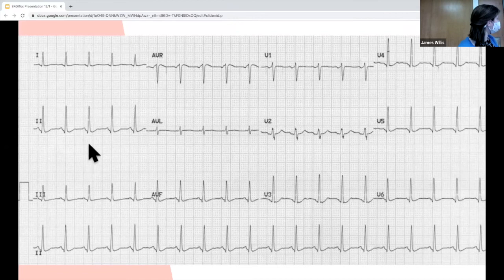And then QRS duration in lead 2, narrow, and then QT. And you can look at the QT in any lead you want. So I think on this EKG it's a little easier, like V2 is set up really nicely where you can measure from the Q here and then the T ends maybe there. A little long.